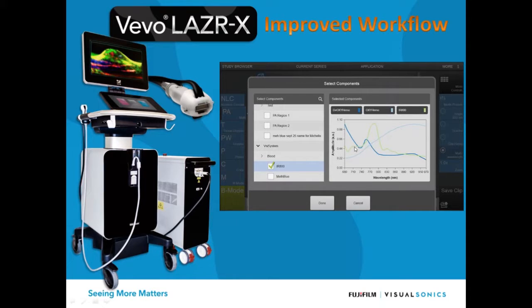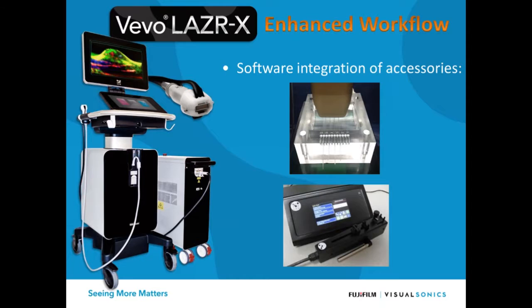Also, when we are using these components, oxy and deoxyhemoglobin, and then things like optical dyes, in this case we've got IR800, a dye made by LI-COR, we've already characterized this dye's curve using the spectro feature, and we can load that curve into the software. Then we can choose it as one of the components for ease of acquisition of those images. All we need to do is tell the system what we're looking for, and it will select all the appropriate imaging parameters.